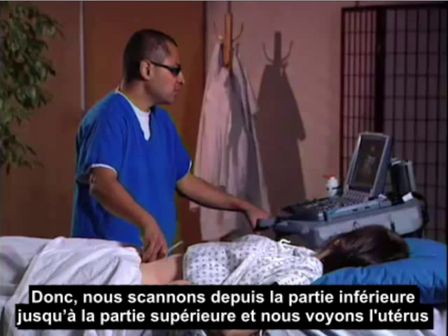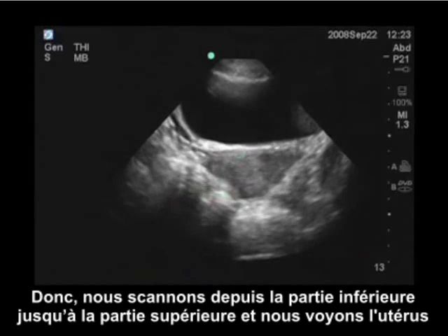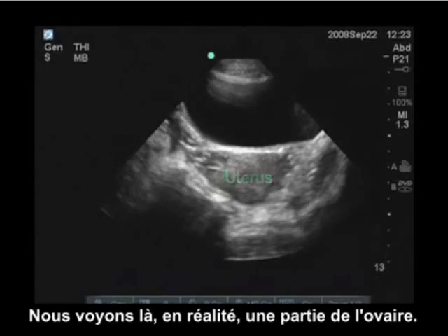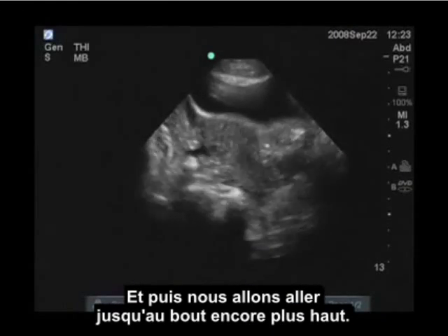So we're scanning all the way inferiorly, to more superiorly. We see the uterus. We actually see part of the ovary there. And then we're going to go all the way more superiorly.